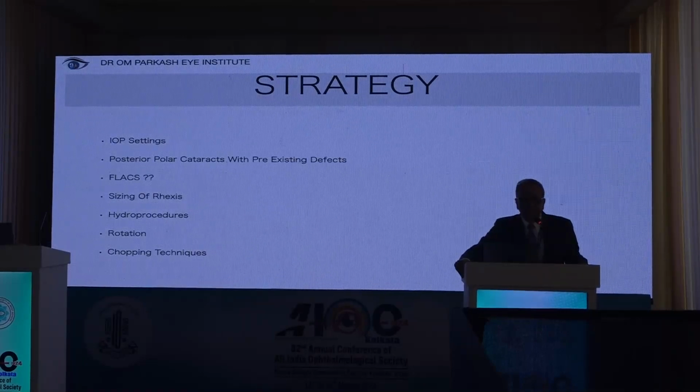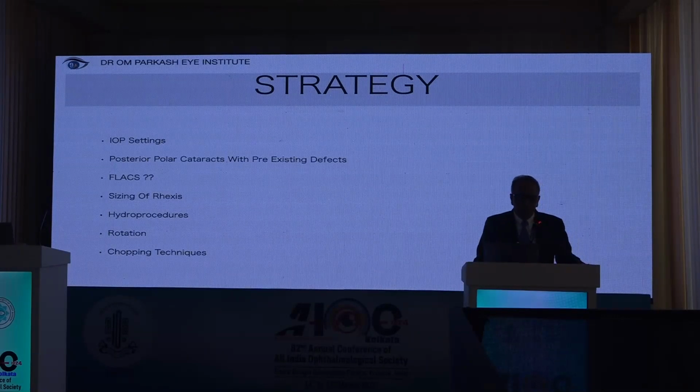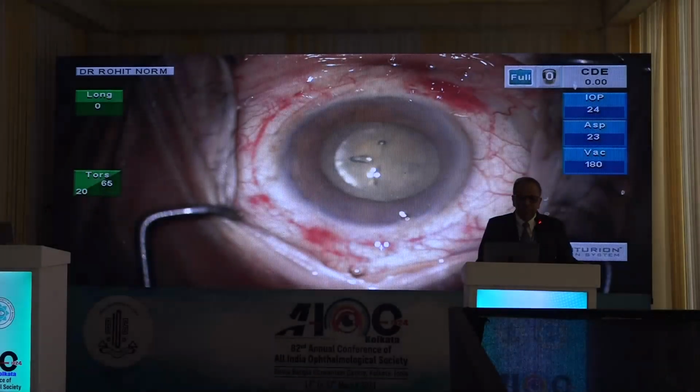Use flax if possible. Sizing of the rhexis, as Dr. Saurabh has said, should never be more than 4.8. Hydro procedures should be avoided. Rotation should be avoided, and chopping techniques have to be customized. So now let's see this patient.